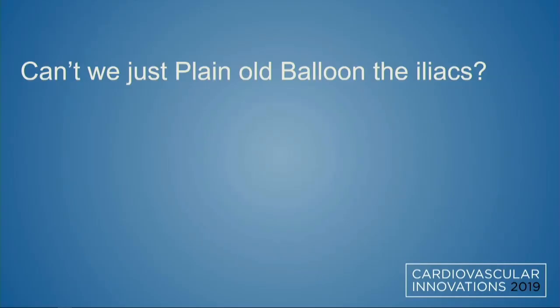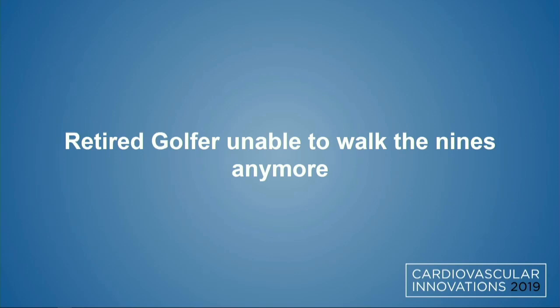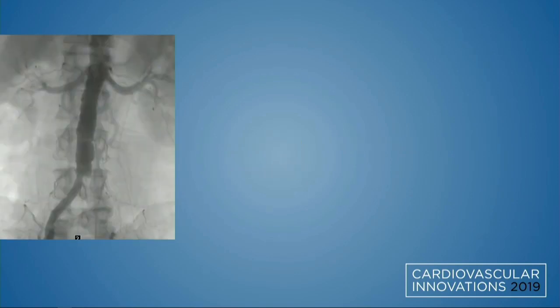Can we just balloon it? I think we've all discovered that no, stenting is better. And the next step is sometimes that retrograde doesn't work. So you have a patient who wants to get back on the golf course, and this is your picture.